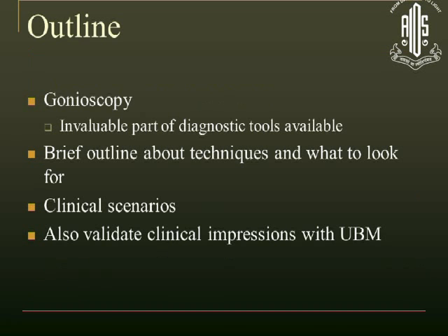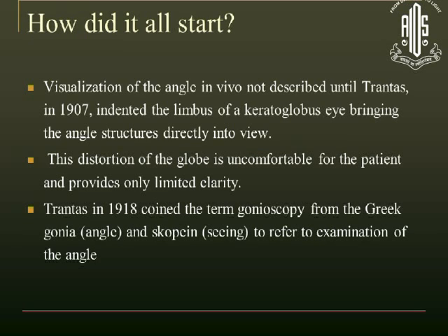Well, the outline of this talk would be gonioscopy, which is an invaluable part of the diagnostic tools available. We'd go through a brief outline about techniques and what to look for, a couple of clinical scenarios, and maybe validate the clinical impressions with the UBM if we have time at the end.